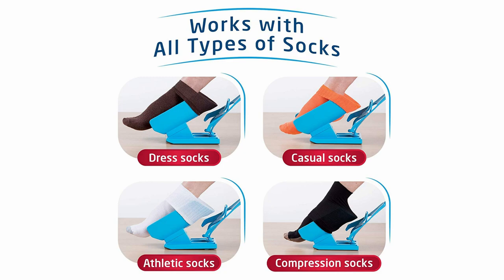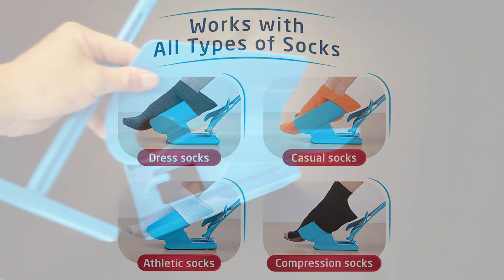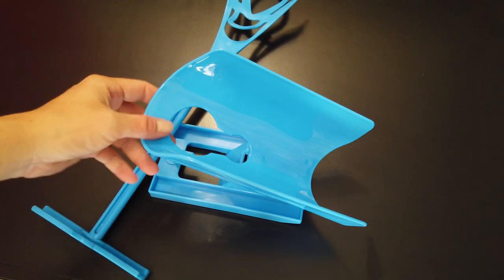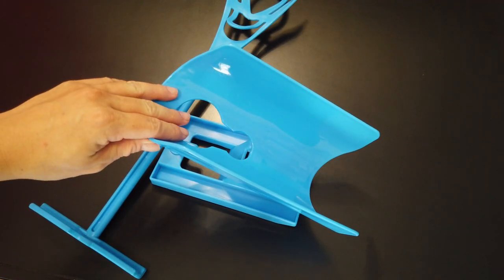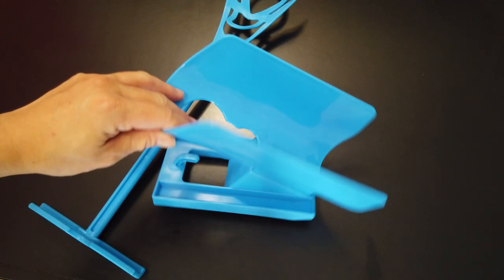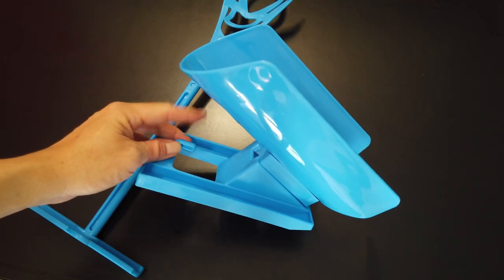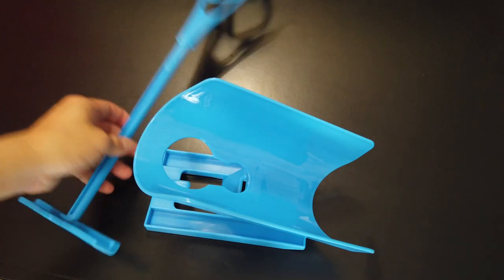Priced around $14 to $15, the Sock Slider comes with two main components: the cradle right here, and below this there's a handy little hook down here. And lastly, the handle.